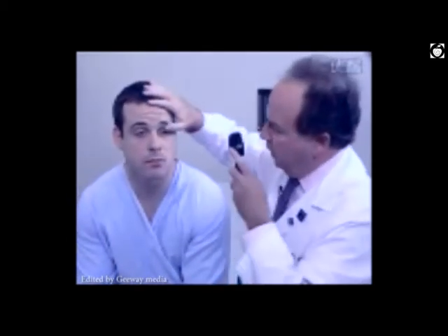We repeat the same procedure on the left eye using your left eye and holding the equipment in your left hand. And again, I'm about 15 to 20 degrees off of midline, and keep looking in the distance. And as one gets closer to the patient, the diopter wheel focuses, first as we go through the cornea, the lens, the vitreous, and now the retina. The optic disc is well visualized, as is the vasculature.